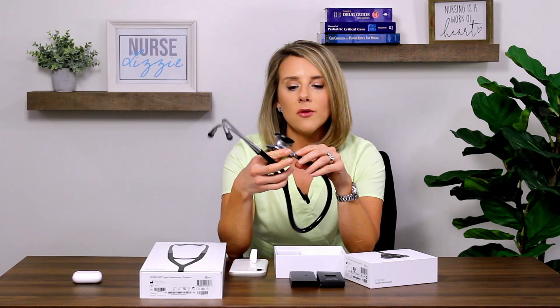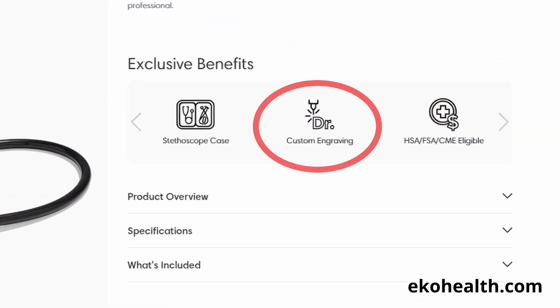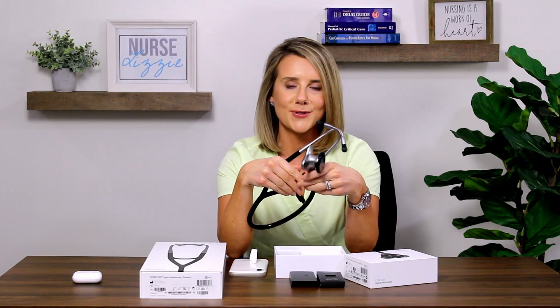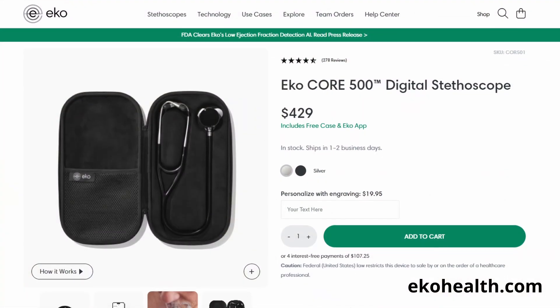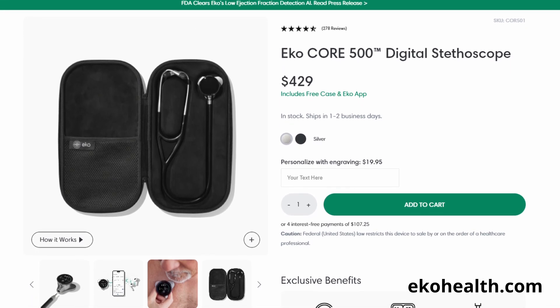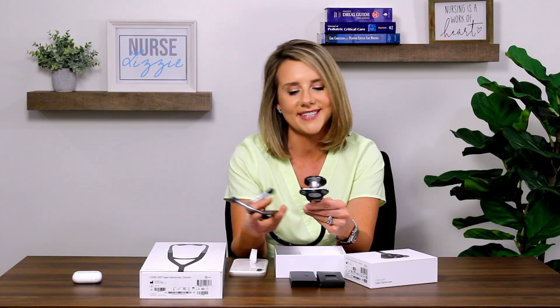Now let's talk about the finishes this comes in. It is available in a matte black or a silver finish. With all Eko products, you have the option at ekohealth.com to personalize this with a fun quote, a saying, or just your own initials — I love that idea, especially if you're gifting this to the person that you love. The Eko CORE 500 also comes with a special carrying case. When you're making an investment like this with a piece of equipment you're using in your day-to-day life helping to take care of patients, you definitely want that carrying case because this is an investment in your future, in your career, and in the patients you're helping to care for.